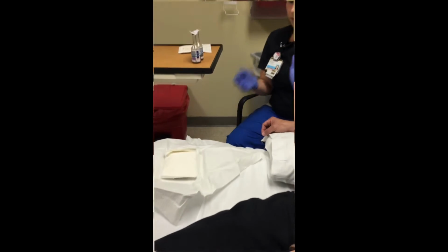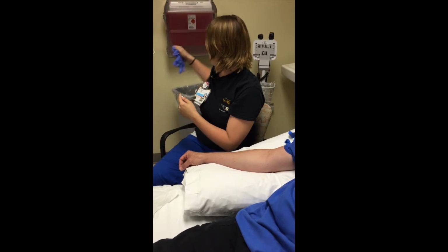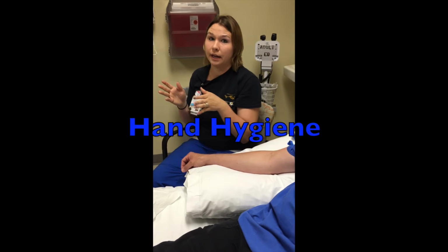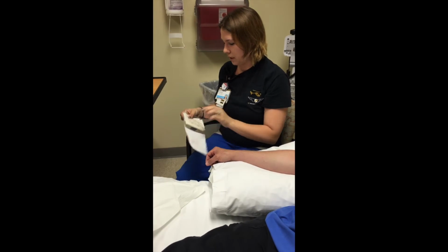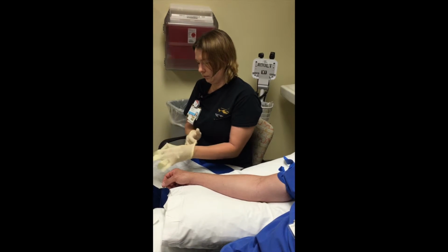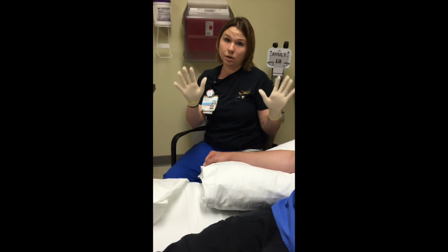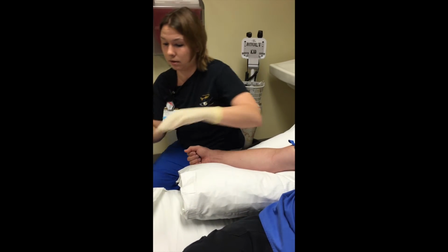You want to take off your regular gloves and you want to perform hand hygiene. So you're going to put on your sterile gloves using proper technique. Once you are sterile, you can actually repalpate the vein because the area is cleansed and sterile.